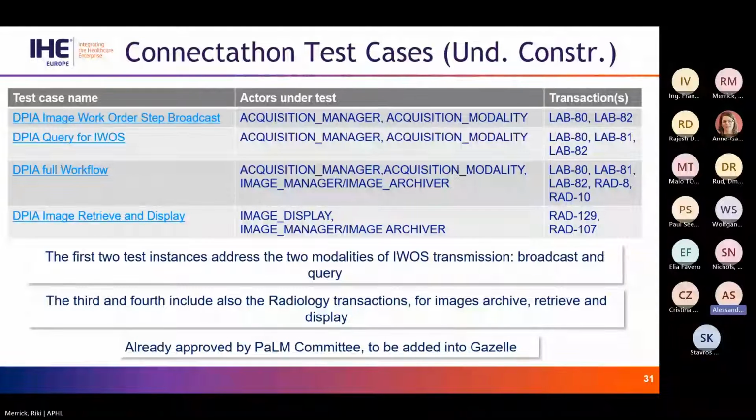And so, according to these profiles, the first two tests address the two modalities that the profile makes available to perform a slide acquisition between the acquisition manager and the modality, that are mainly broadcast and query mode. So we are testing these parts.